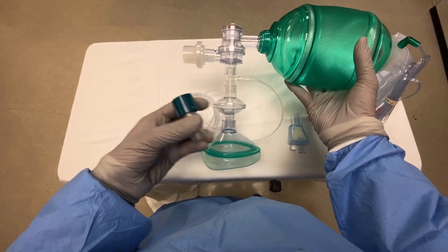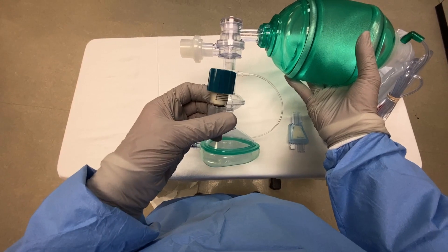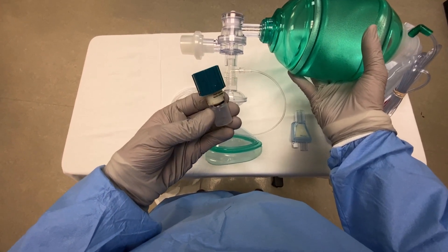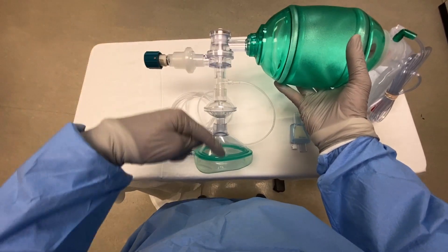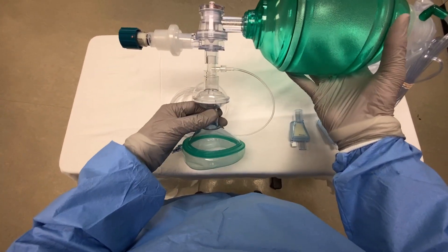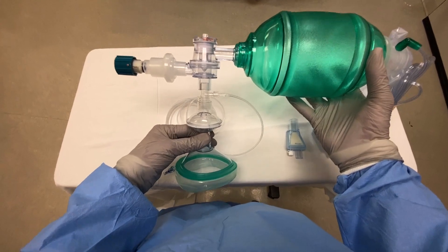The peep valve as we have it is set to zero. When it's set to zero, it acts as a one-way valve, so it effectively separates inhalation and exhalation and can be used to pre-oxygenate the patient in place of a non-rebreather mask or other mask.